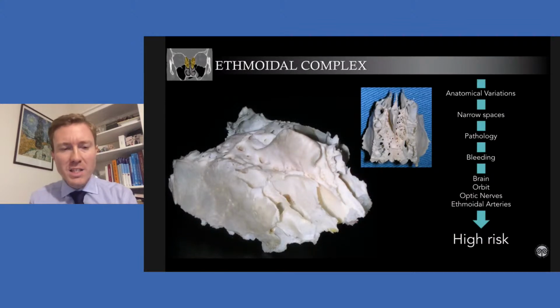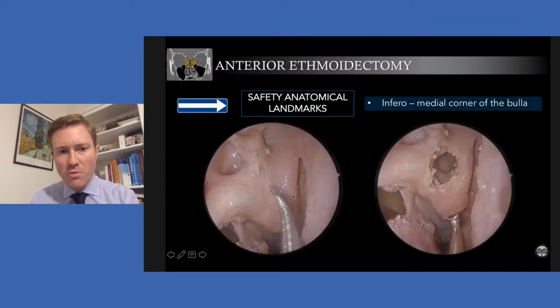Okay, once the maxillary sinus has been opened, we can move to the second sinus to be approached. The second sinus to be approached is the ethmoidal labyrinth, the ethmoidal complexes. You can see the ethmoidal complexes is a very narrow and very bleeding space, and you have to disassemble the ethmoidal complexes in order to clean the ethmoid without damaging the orbit, the brain, and the lateral lamella.